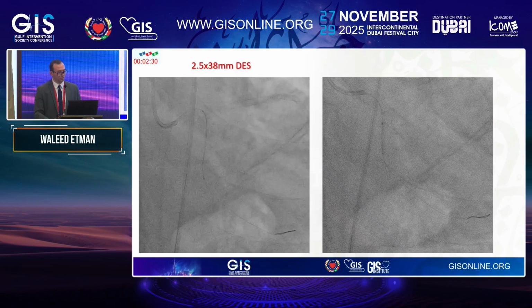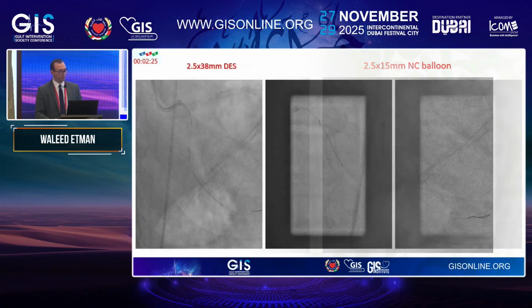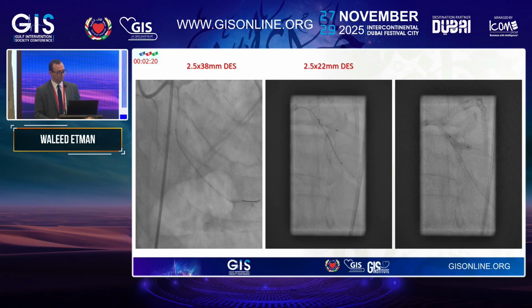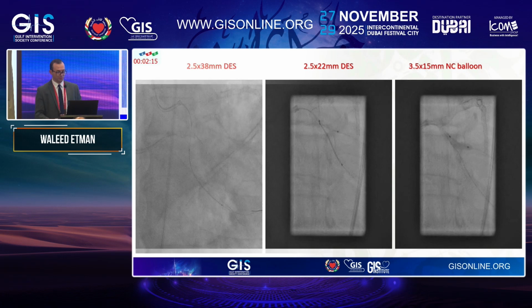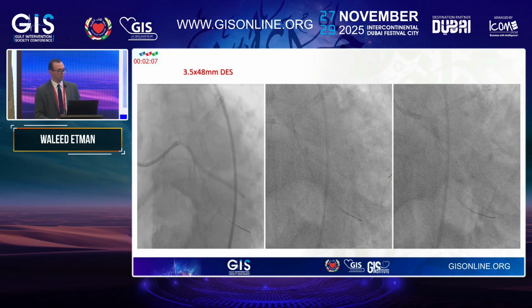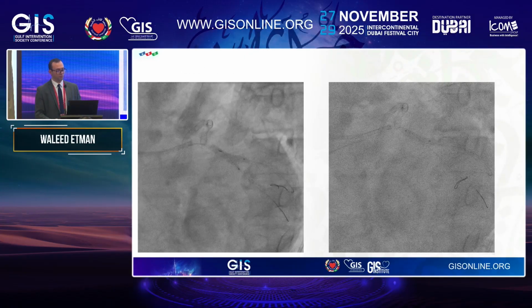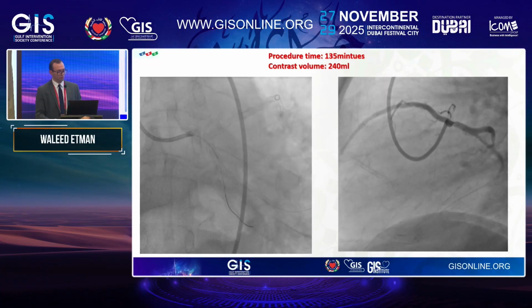So we began to stent. I brought a 2.5 by 38 stent; it didn't pass. I brought another larger balloon. Now it passed. So we did an inverted DK crush, considering the obtuse marginal, the larger branch, as the mother vessel. Then after crushing the stent, we crossed the wire, first kissing balloon. Then we inserted a 3.5 by 48 drug-eluting stent, POT. The balloon didn't pass, so an anchor balloon for the second stent, for the second kissing balloon, a re-POT, and this was our final result.